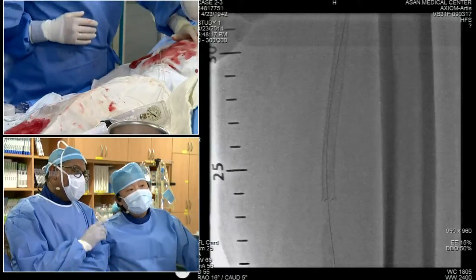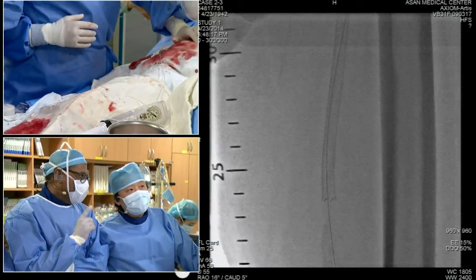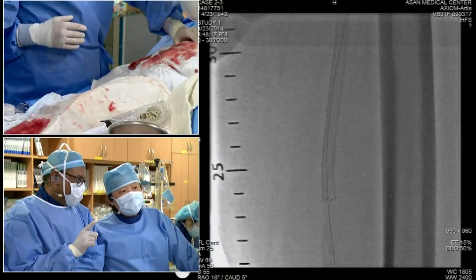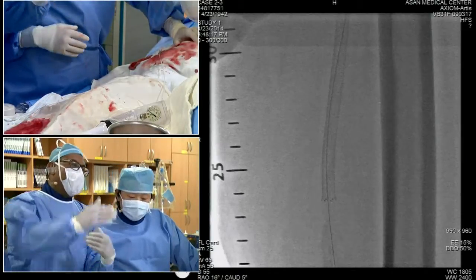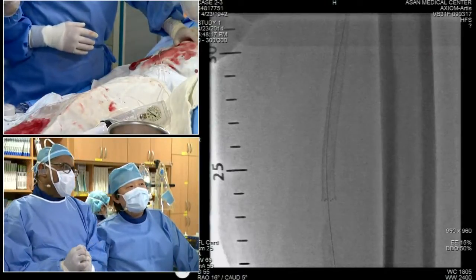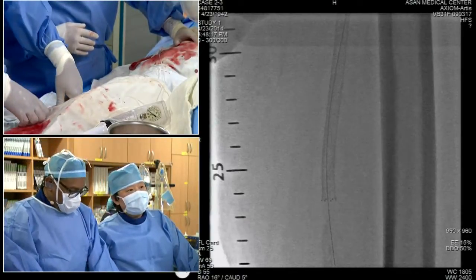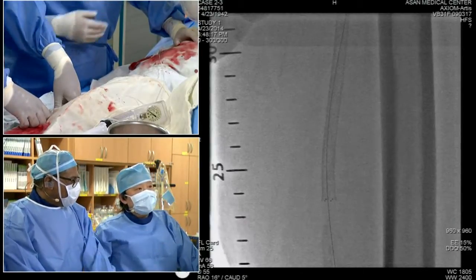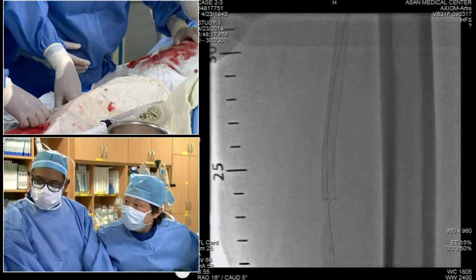There's just a lesion. Yeah. So what are you going to do within this occluded stent? Angioplasty alone, or angioplasty plus a stent? Angioplasty versus stent. Okay. So you're going to stent the whole segment. Yeah. I want a drug-eluting balloon, but I think that DCB is not available in your hospital. Available? Okay.